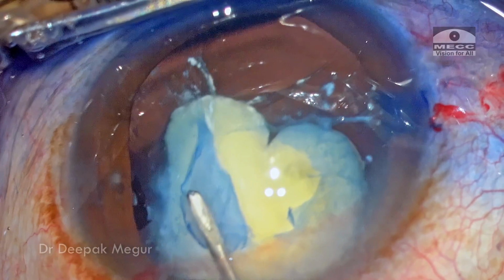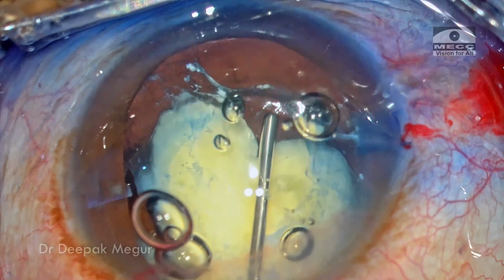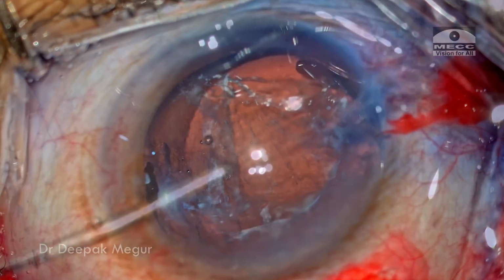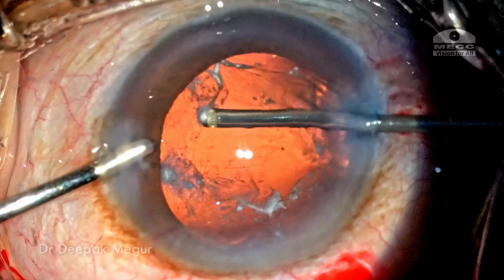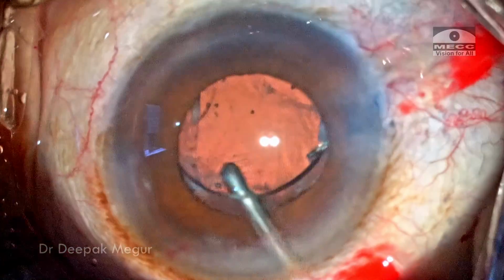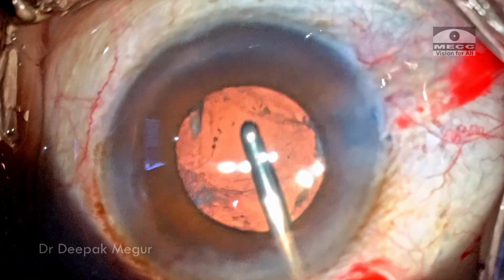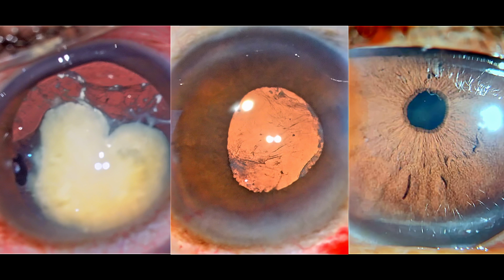So to summarize, this was a case which was challenging in many ways, and salvaging the bag looked quite difficult to begin with. But nevertheless, with a little bit of patience and appropriate planning, we can manage to save these very flimsy bags and place the lens into the sulcus. Of course, just sacrificing the bag and putting an iris clip lens also isn't a bad option, but this is something which I tried and worked for me.